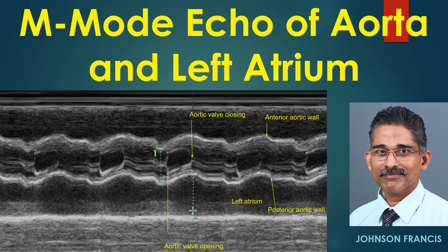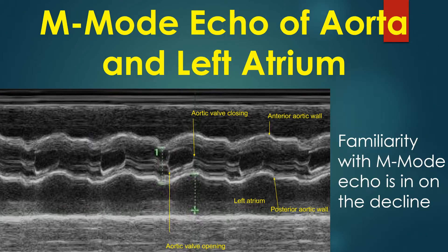M-mode echocardiogram of the aorta and left atrium. M-mode is short for time motion mode, where the X axis is time and the Y axis is the motion of the structure being imaged. Familiarity with M-mode echocardiography is on the decline. In the initial era of echocardiography, it was the only modality available. The M-mode echocardiogram at the aorta-left atrium level shows the anteroposterior movements of the walls of the aorta, along with the aortic valve opening and closing movements.